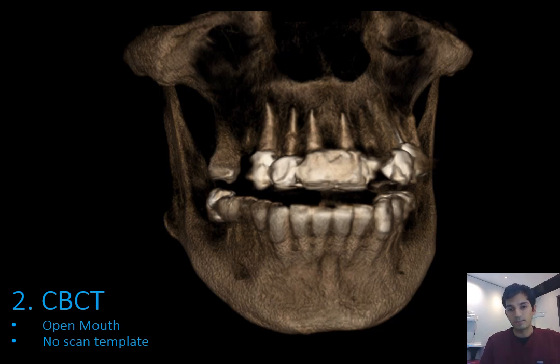Firstly, you want to separate the maxillary and mandibular teeth. This is achieved by either placing some rolls of cotton around his molars for him to bite on, or placing some gauze between the arches. This makes it clearer when reviewing the scan data without any crisscrossing between the two arches. It also reduces scatter by keeping that gap, or that section of air, between the two arches.